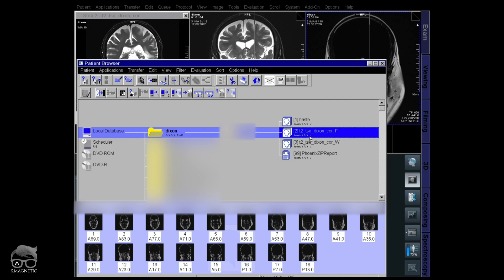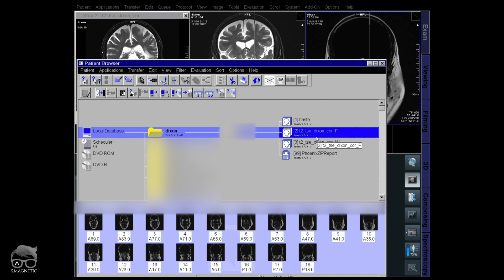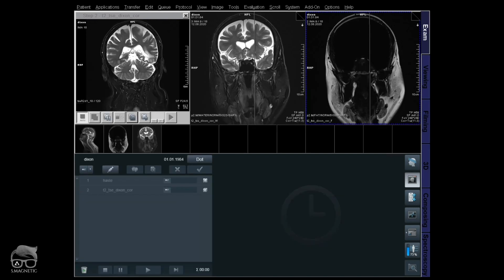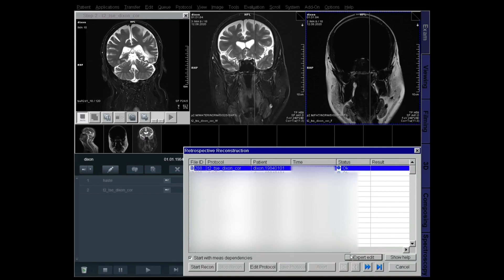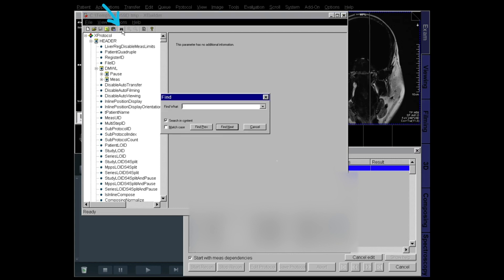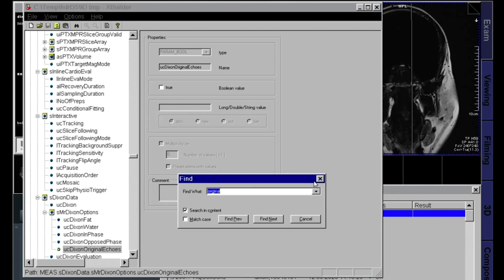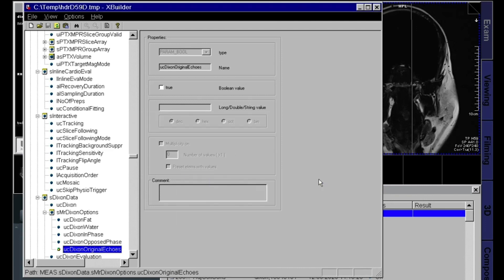What you can do now is down there you have this echo icon. So hold down your shift on your keyboard and then left mouse click and you come into the retrospective reconstruction, right there. Locate your sequence, which here is the first one, and then go down to expert edit. So what you can do now is go for the goggle, that's the search mode. Write original and then you can just close that search tool.